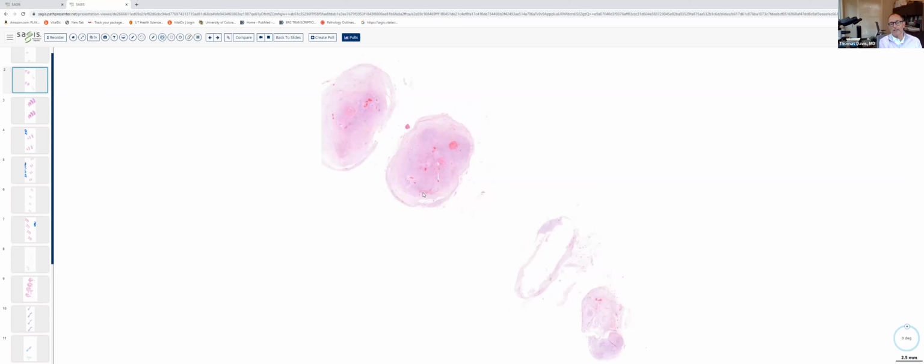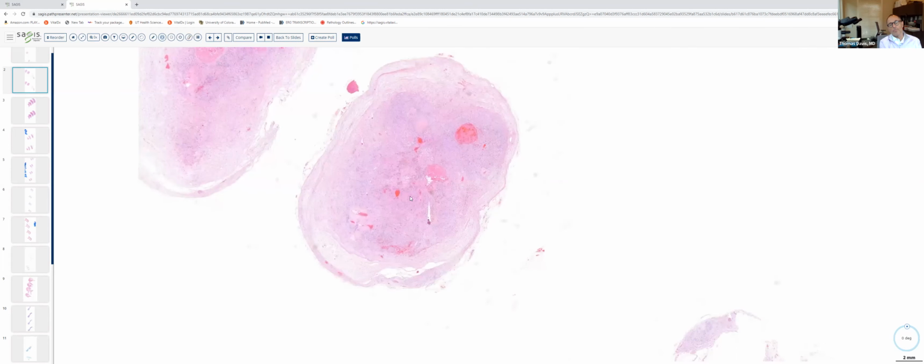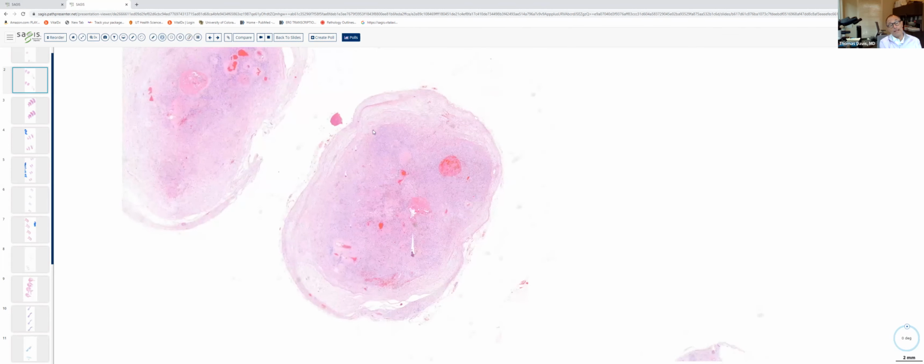It's always good to study a neoplasm at low power and assess the overall architectural configuration and try to get a feel for whether one is dealing with a benign or malignant tumor. Certainly well circumscribed and relatively symmetric. So again, it has a very benign silhouette. As we begin to move to higher power, we can see that this pink ball in the subcutaneous tissue has areas out at the periphery that are a little more loose, probably not as cellular as those zones in the central portion of the tumor.